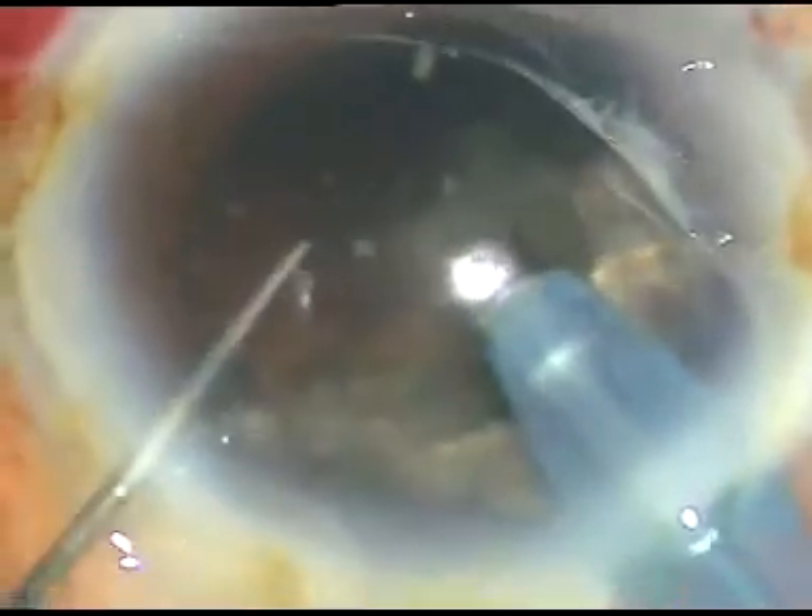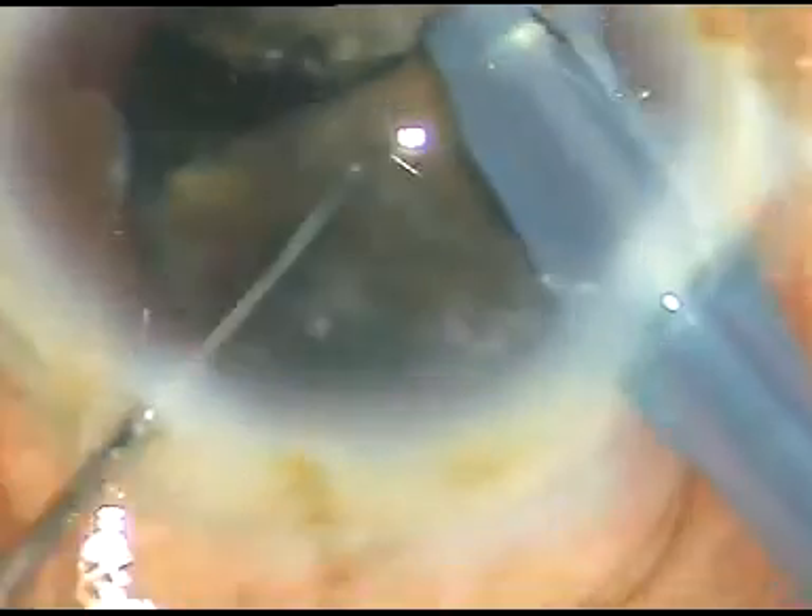I always try to protect the posterior capsule, and I work a little behind the iris plane so that I also protect the corneal endothelium. One can use viscoat and HPMC — a modified soft-shell technique — to initiate the case. In this case I used HPMC, which is good enough if we take adequate precautions and remain at a safe distance from the corneal endothelium. If we follow these rules, we can protect both the corneal endothelium and the posterior capsule.